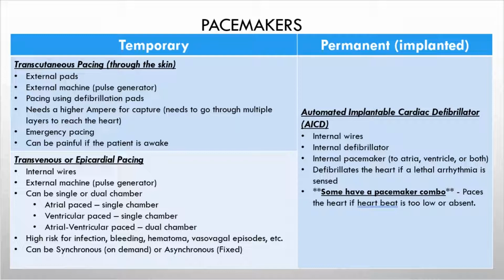Transvenous or epicardial pacing, this is the one that we'll be focusing on more in this talk, means that the wires are internal, either on the epicardium or inside one of the chambers of the heart, depending on which one it is, but the machine is external. The one we'll be discussing is a dual chamber generator, as the Medtronic is, and the modes that we're going to discuss include on demand, which we call synchronous, or the asynchronous or fixed mode.